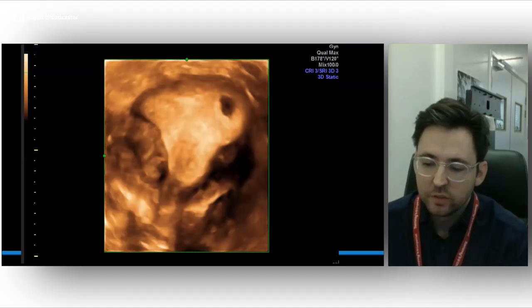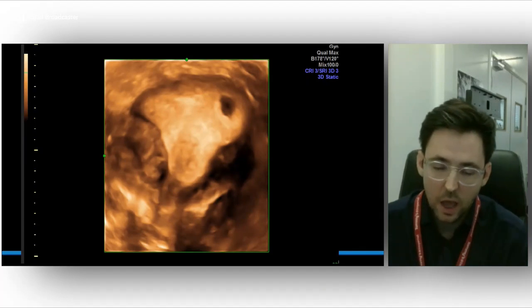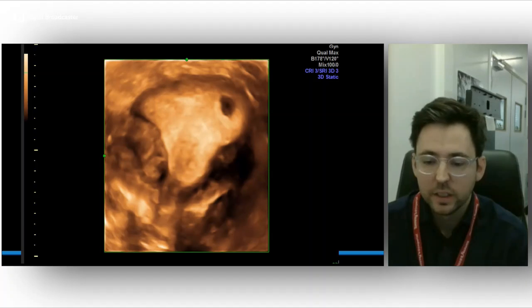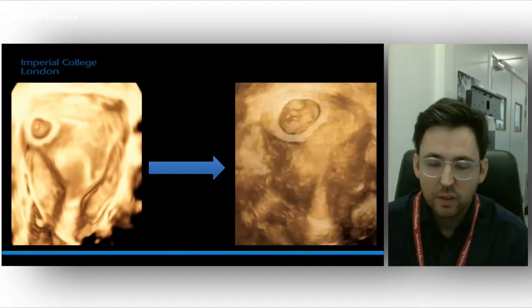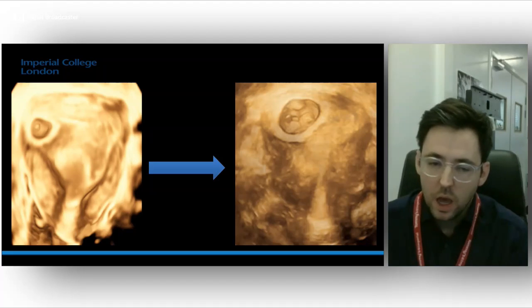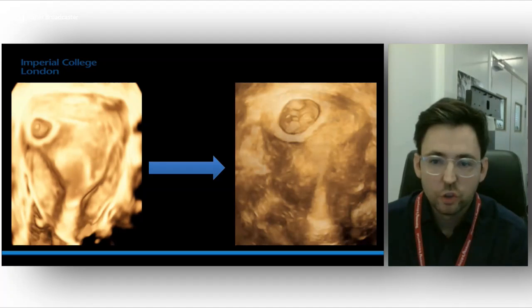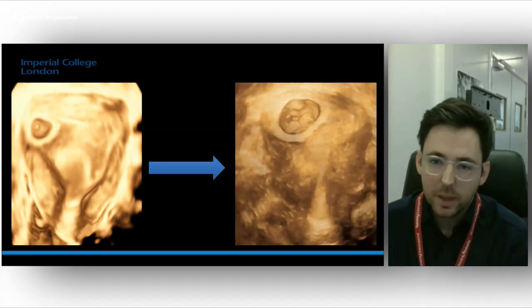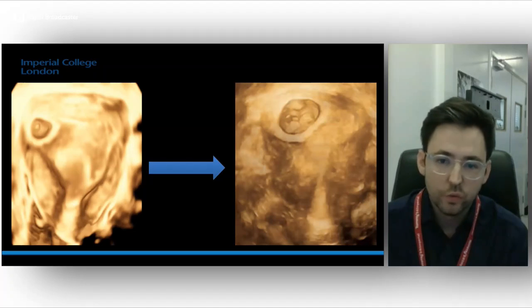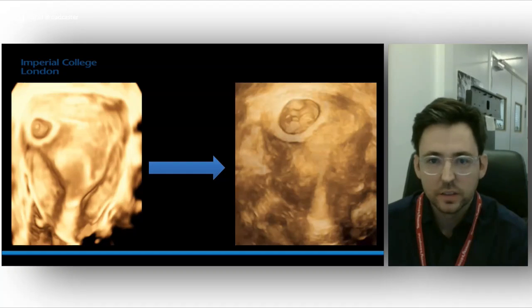With TV ultrasound, further advances have now led us to have 3D ultrasounds. And as you can see in this image, the pregnancy does indeed appear to be in the endometrial cavity. And again, if we rescan and use 3D imaging, we can see this pregnancy centralized in the endometrial cavity. I think the important part of these images is to note, if you are unsure on the location of the pregnancy, don't make a diagnosis on that initial scan. Re-image at a later date or refer a patient to a centre with expert scanning facilities.